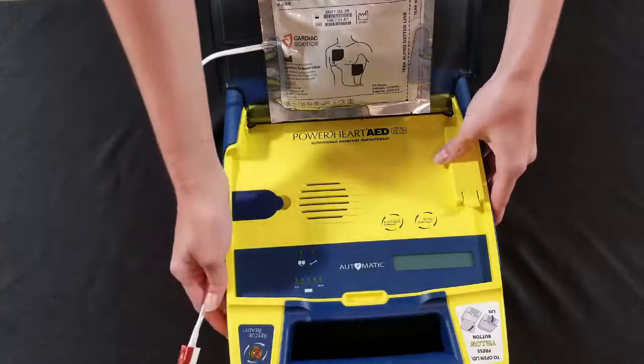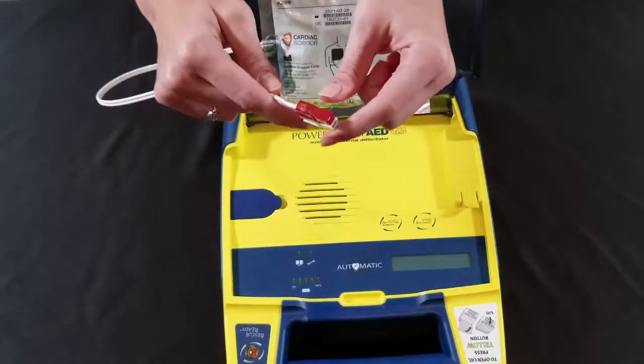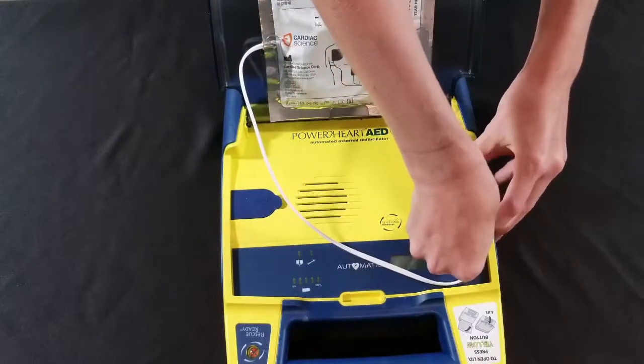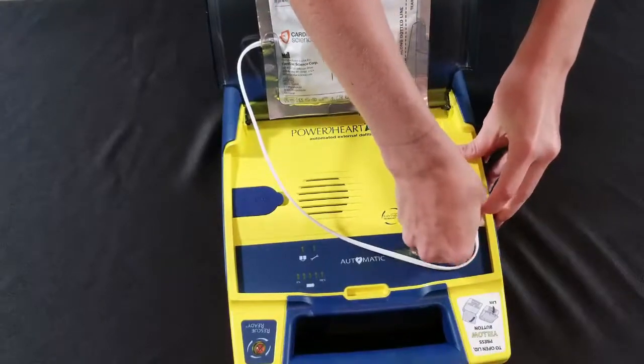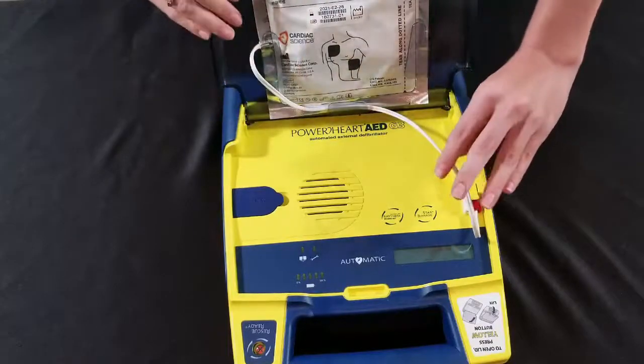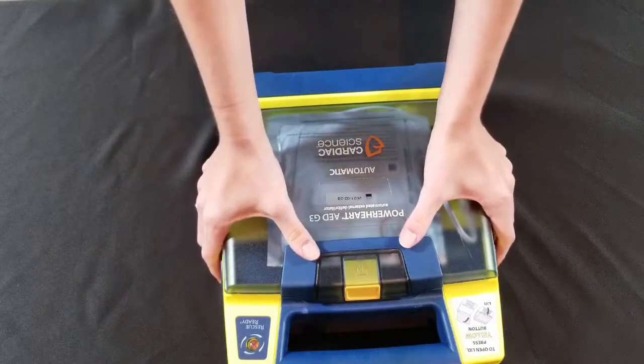Then match the red and white on your device with the red and white on your cable and plug those in. Run the wire through the guide and close the lid on your device — it might be tough to close, but that's okay.